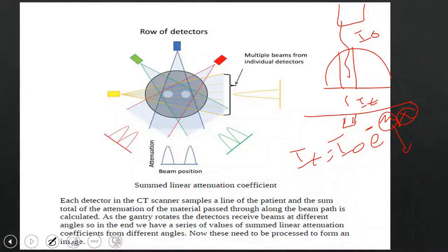The attenuation coefficient of the organ or object that I am imaging indicates the ability of this organ or object to attenuate radiation by a certain amount. From this equation, you can determine the transmitted I for yourself. The main factor that the topic depends heavily on is the attenuation coefficient. This attenuation coefficient varies from one material to another.